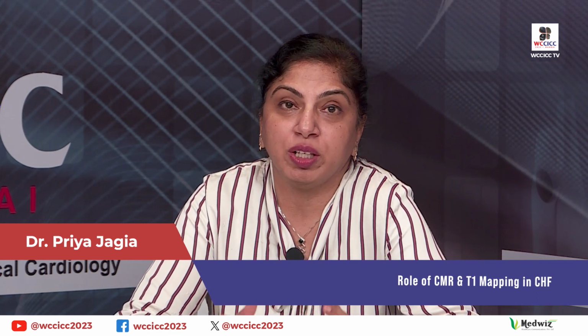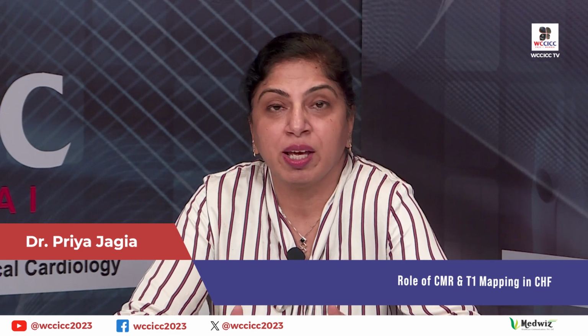So, if there is increased scar burden or the transmurality of the infarct as seen on the late gadolinium enhancement images is more than 50%, that is, if the scar thickness is more than 50%, the segment is less likely to be viable. And it has been shown that the LGE acts as a poor prognostic feature. So, presence of LGE and extent of LGE act as a poor prognostic feature in patients with heart failure.